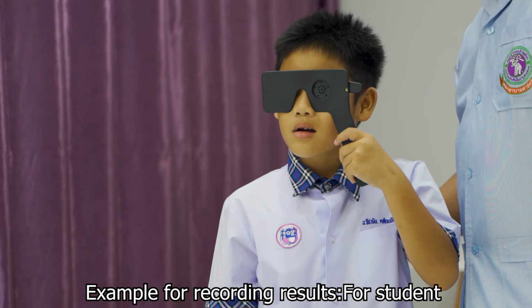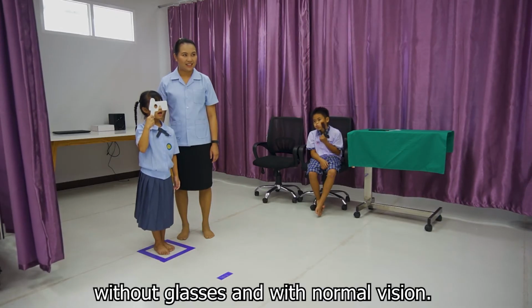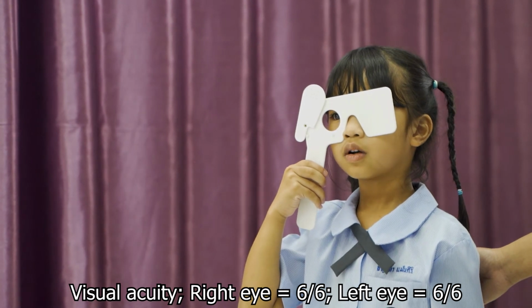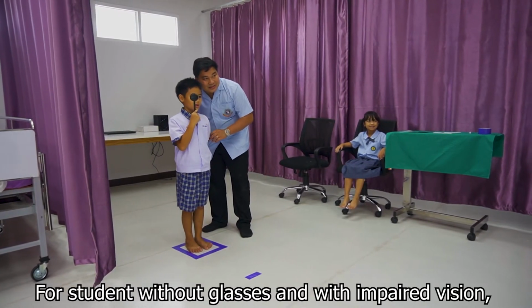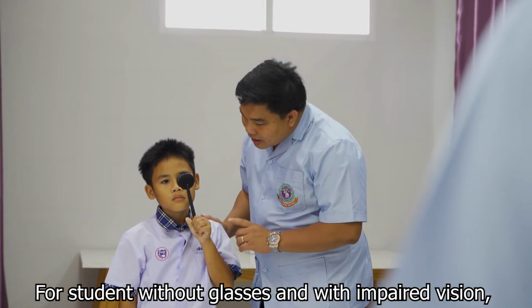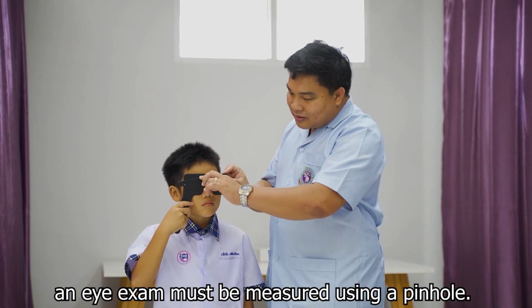Part 5. Recording the results. Example for recording results for students without glasses and with normal vision. Visual acuity: right eye equals 6/6, left eye equals 6/6. For students without glasses and with impaired vision, the eye exam must be measured using a pinhole.